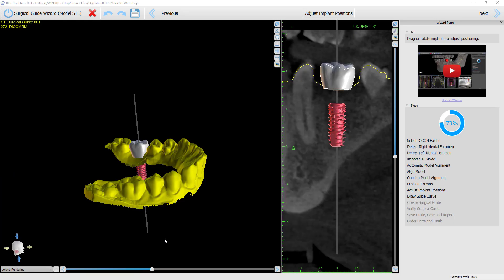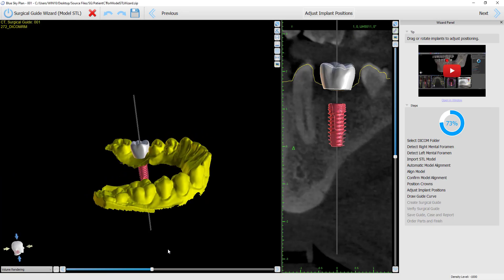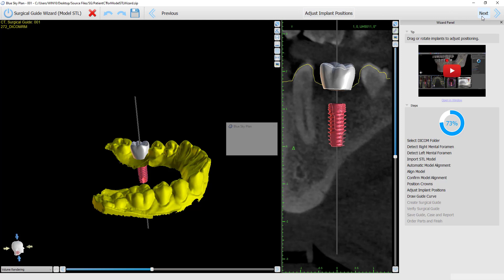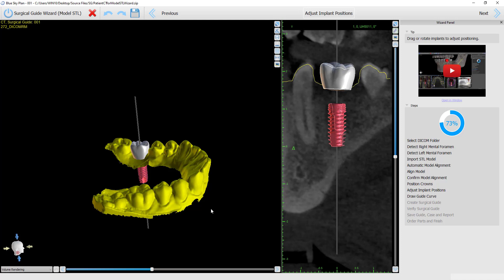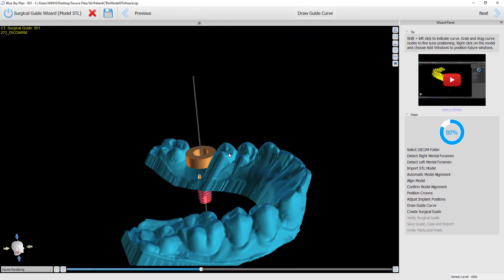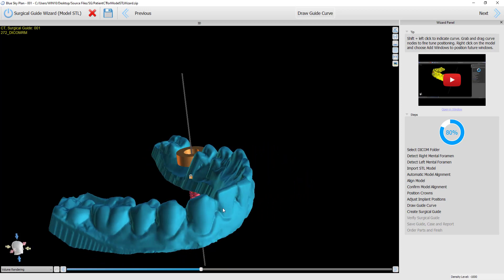We now provide a visualization when using the wizard. As you go from placing and adjusting the implant position to drawing the surgical guide, we show the model with undercuts removed at a 30-degree angle, as you can see here.